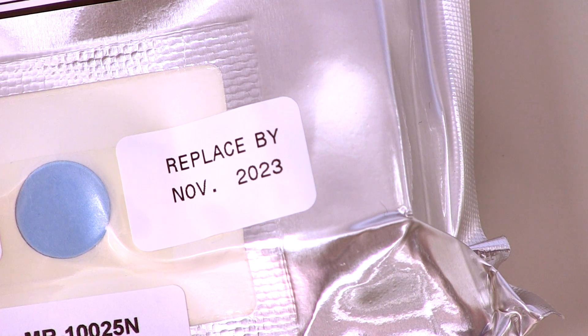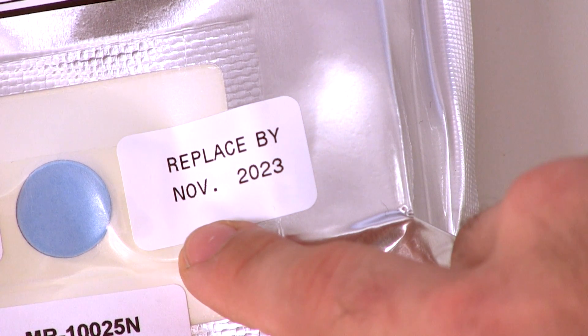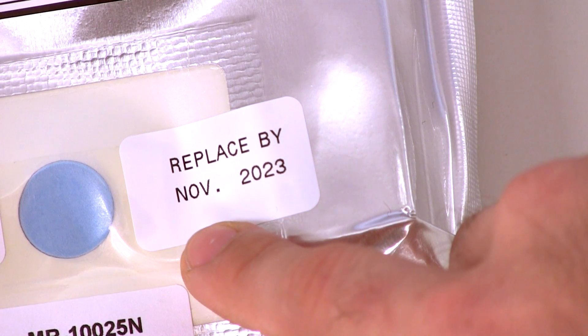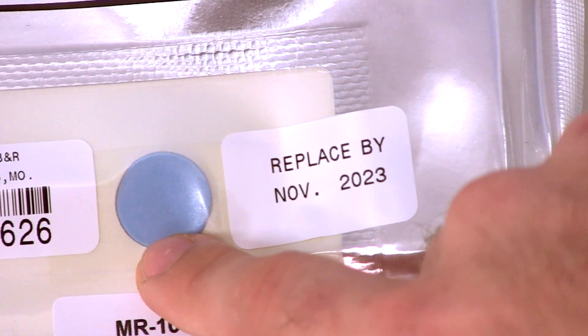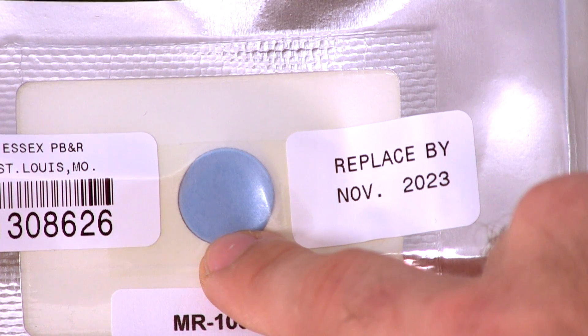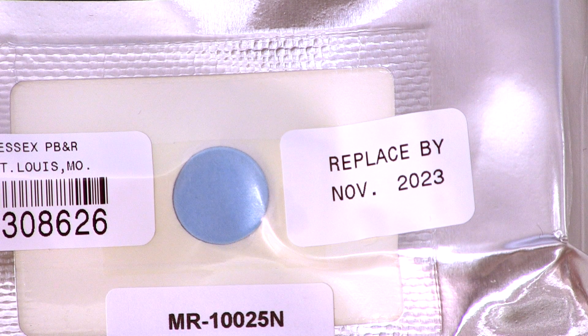To inspect the VRU Plus, first check that the replace-by date has not been exceeded. The VRU Plus has a 10-year shelf life. Then inspect the humidity indicator. The humidity indicator should always be the color blue. If it is pink, do not use the hood and contact Essex for return authorization.